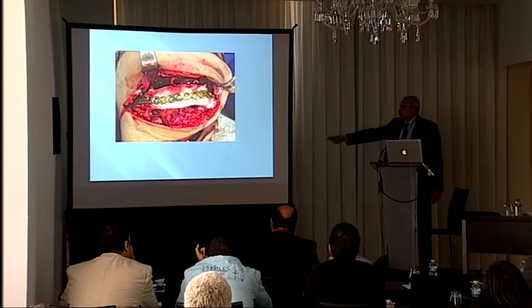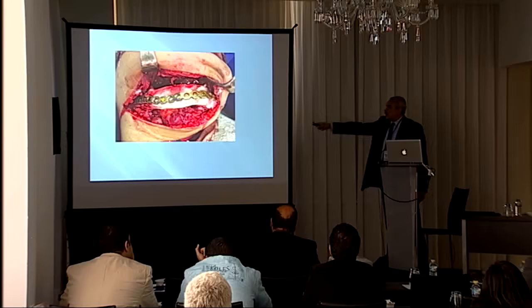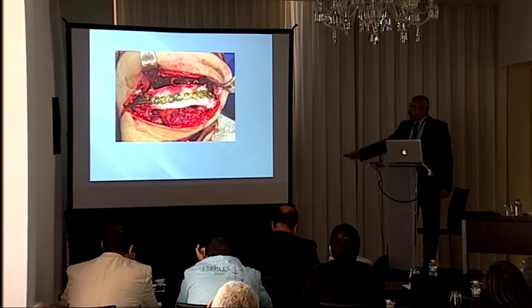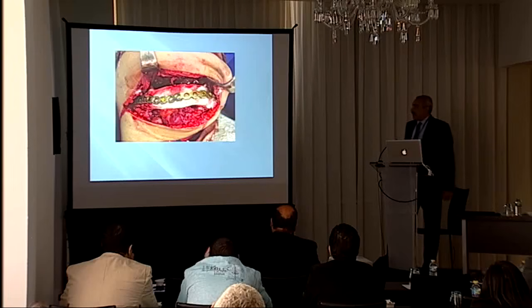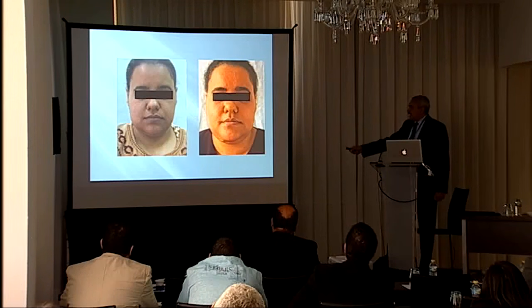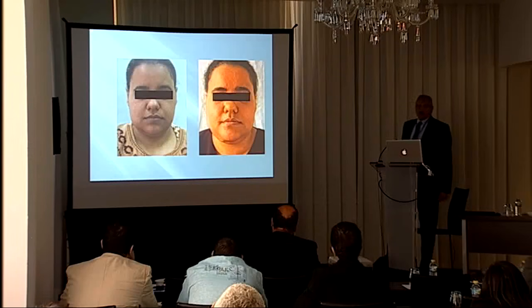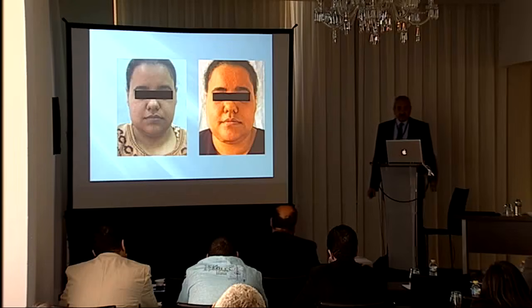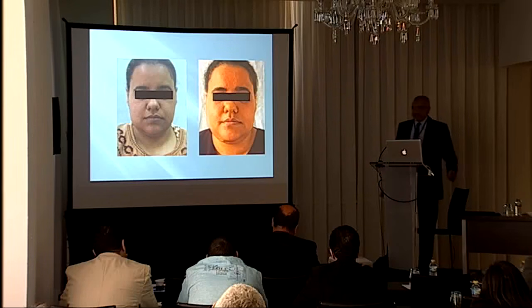And here, after we fixed, we placed the bone substitution material that was labeled with BMP2 and with bone marrow extract. Then we can see the patients. You see a little puffy here, and that is usual with the use of the BMP. Sometimes this puffiness lasts for as many as 4 to 6 months post-operative.